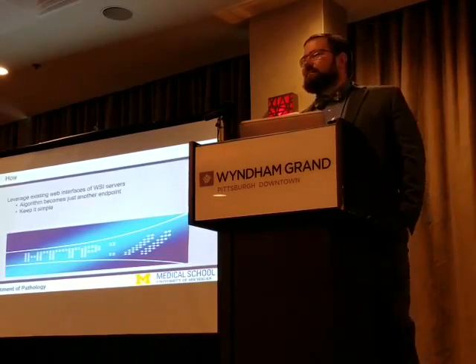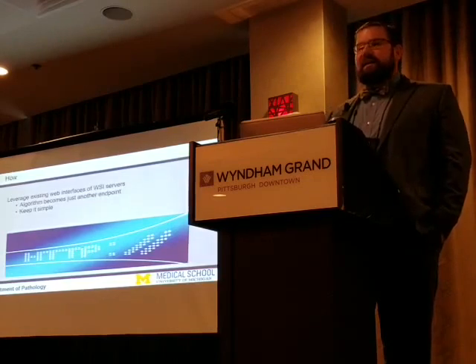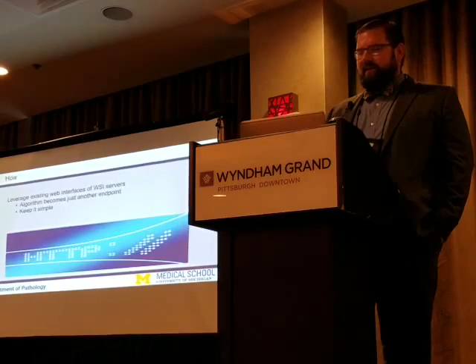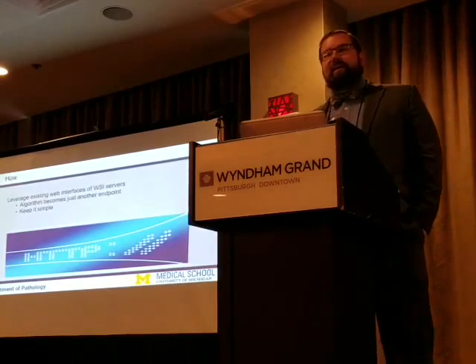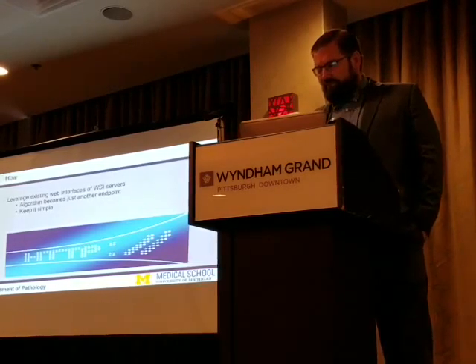So we wanted to keep it simple, keep the development effort to a minimum. So basically, just forking this feed and reusing it for another purpose. As the viewer is asking for tiles to display on the screen, it also sends that same information to the algorithm for processing.